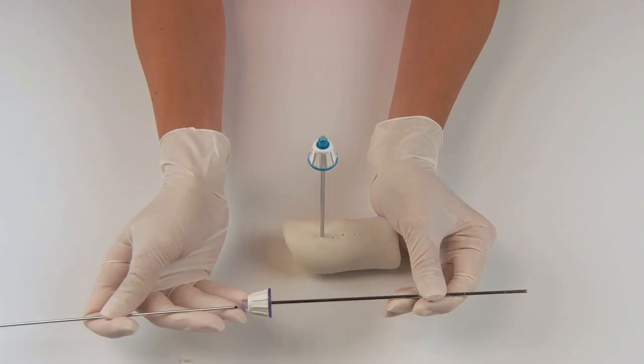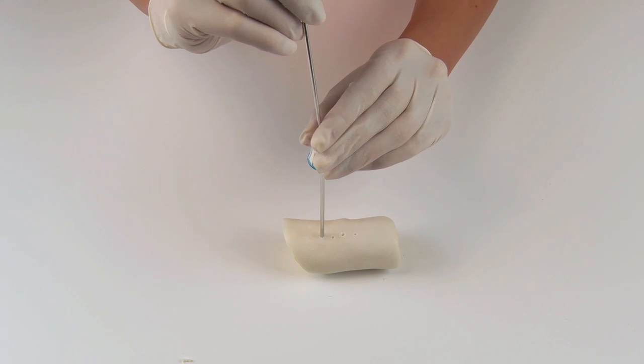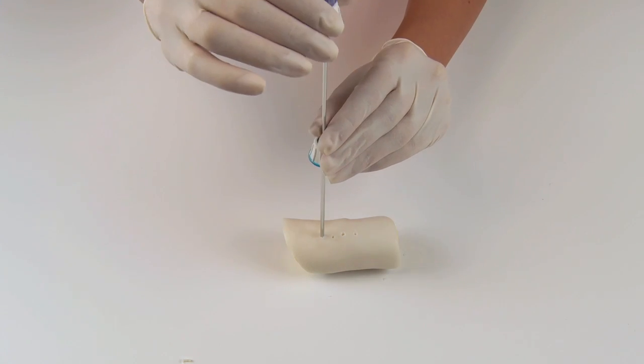When performing multiple sampling, the stylet should remain in the biopsy needle until the new sampling location is reached in order to avoid contamination of the following samples.